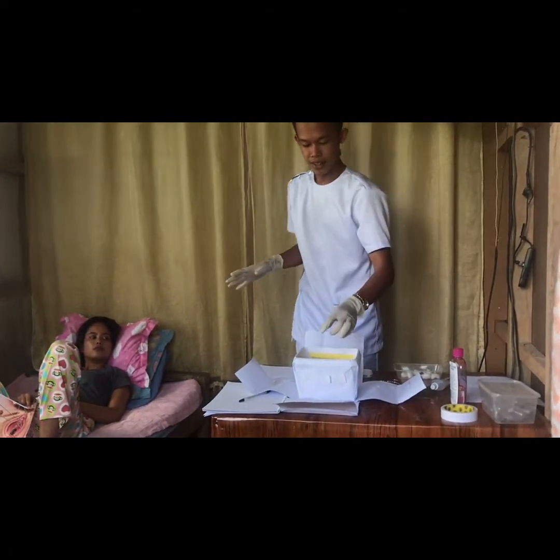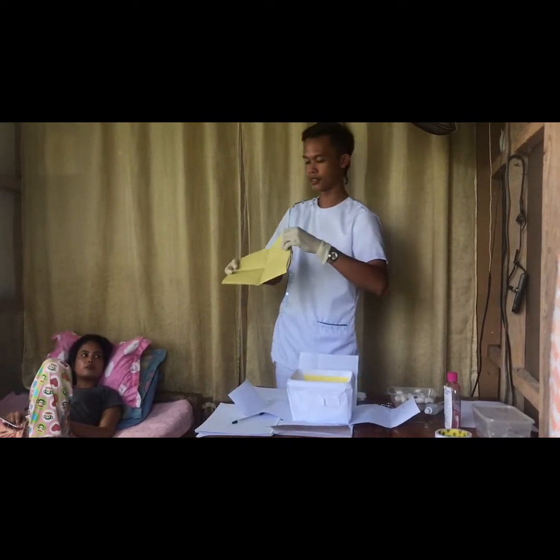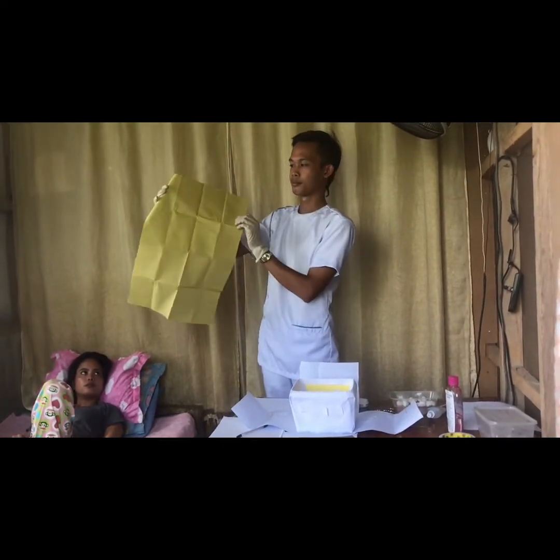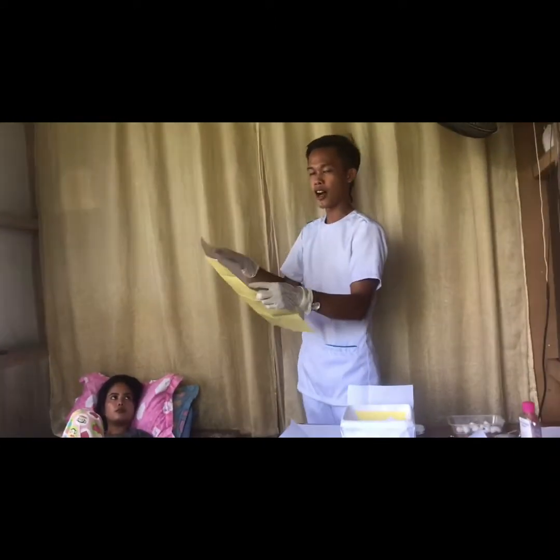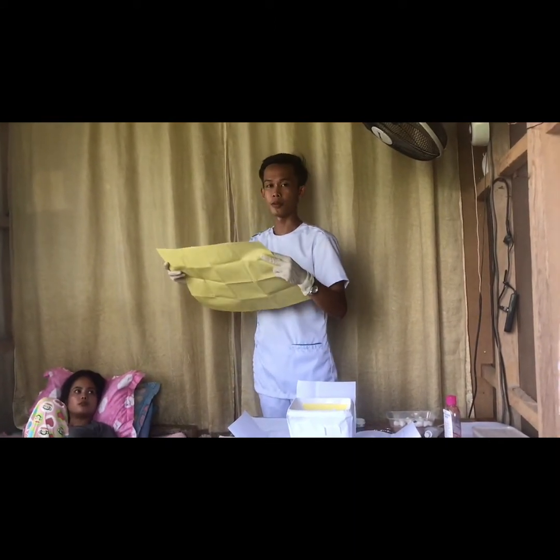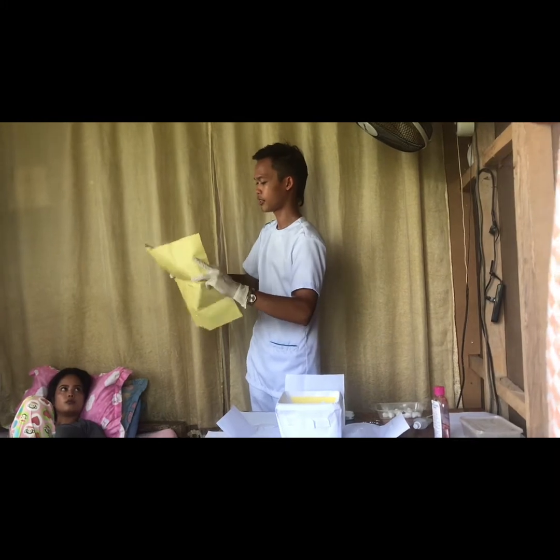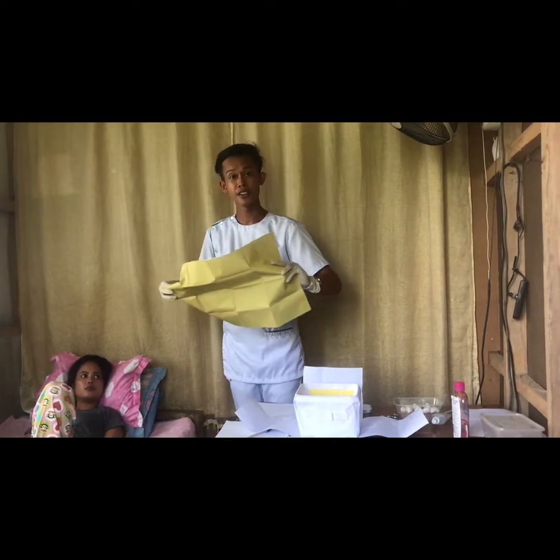And then after that, yes, I have here my drape. Okay, so the drape itself has two sides, which is the shiny, and then we have the not shiny. Okay, so this portion is not shiny, it absorbs water. Okay, so for this time I'm going to insert it underneath the patient. I'm going to wrap the drape something like this.